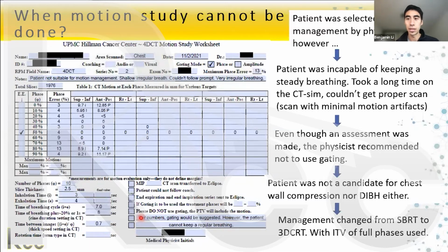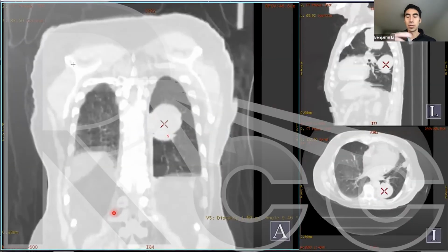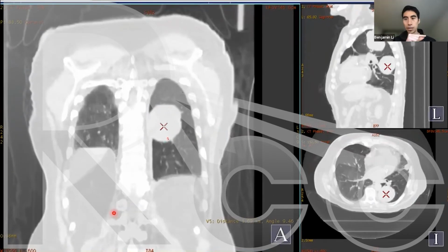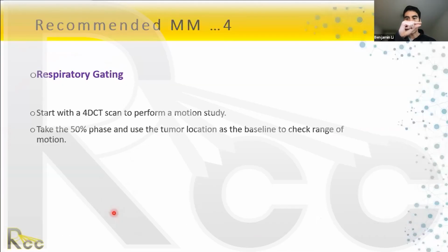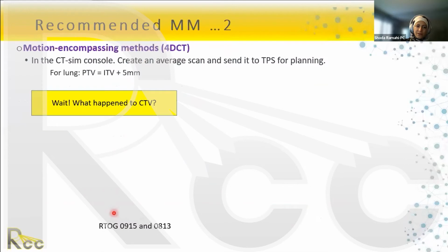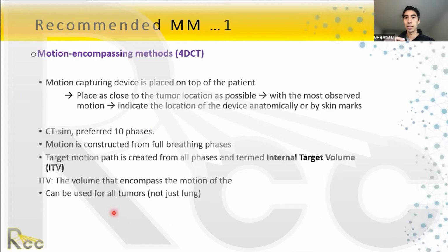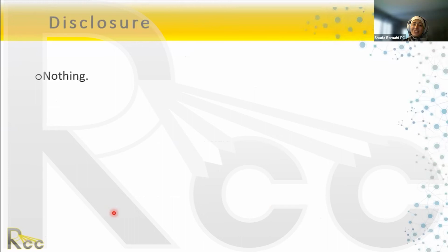I sort of wrote that. It's describing from 0% to 50% to 100% the part of breathing, the phase, where we're trying to get from 0, starting at inhaling. We exhale, and we go up to 50, and then we inhale again, and we get back to 60, 70, 80, 90, 100. And at 100, we basically start over, and now we're at 0. All right, hold on. That's hard in English. Maybe you can say it in Arabic.